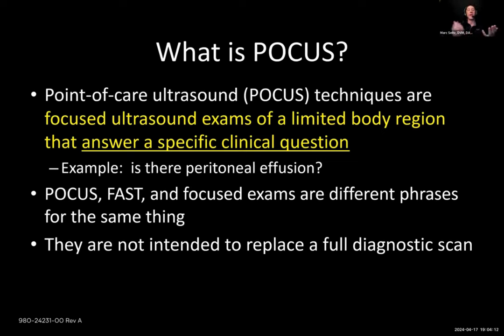And the other thing that's nice is it helps complement some of my other tests. So many times in general practice and emergency, I would get my blood work back and go, wait, anemia, that's weird. Wasn't expecting that. Or, hey, there's an elevated liver value or renal azotemia. And I wanted to check and make certain that there wasn't peritoneal effusion that could indicate a more serious condition.